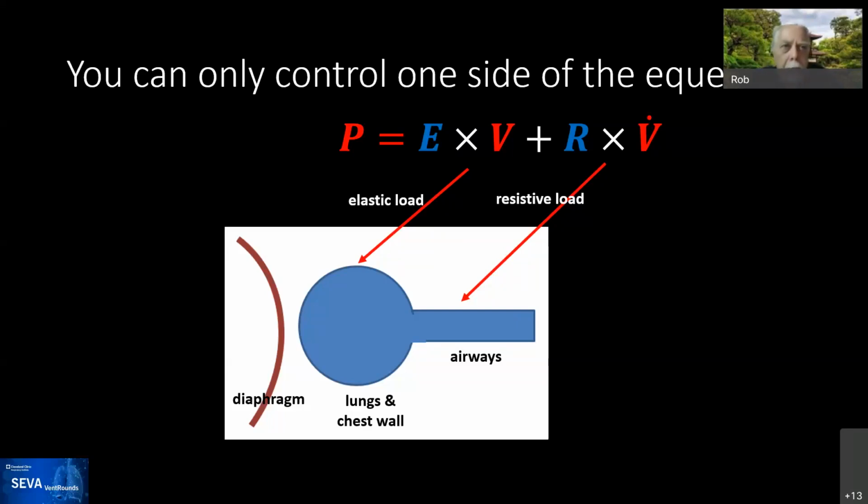And in order to get that definition, we have to base it on some sort of theoretical framework. We just can't make things up as we go. So as it turns out, there is a mathematical model that has been in use in pulmonary medicine way back since the 50s, and by the way, has been borrowed from electrical engineering. In the electrical engineering world, resistances are called resistance, and compliances are called capacitance. They operate the same way an electrical circuit says those things operate in the human body.